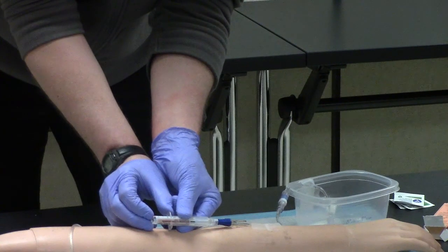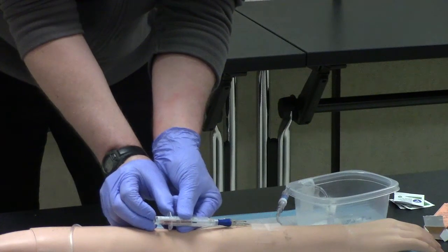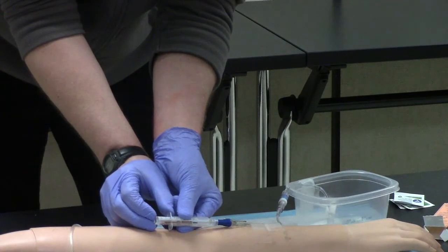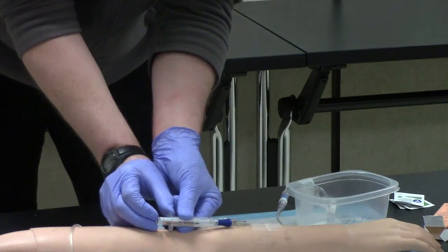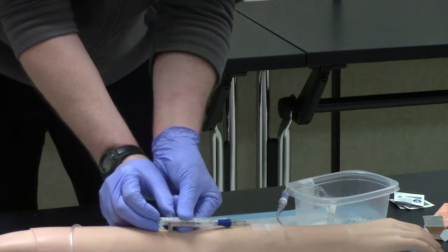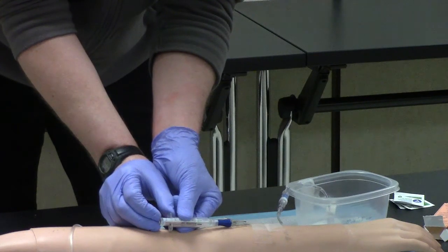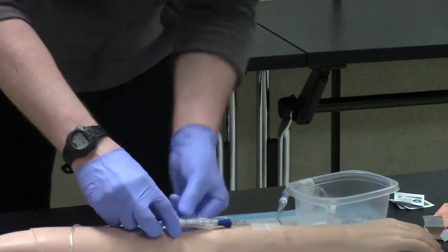Okay, I have about a milligram inserted at this point. Once again, if my protocol was 1 to 2 milligrams, I would administer the entire syringe, watching for effects. Okay, I'm at 1.5 milligrams. Alright, and 2 milligrams.